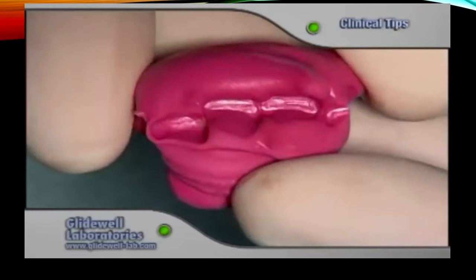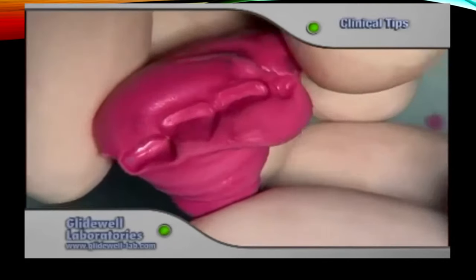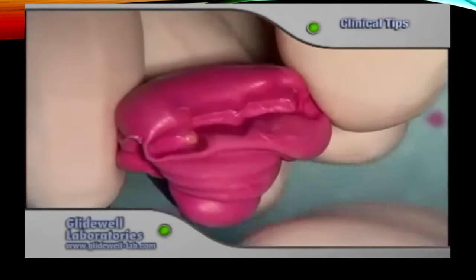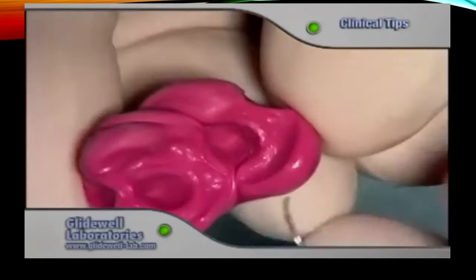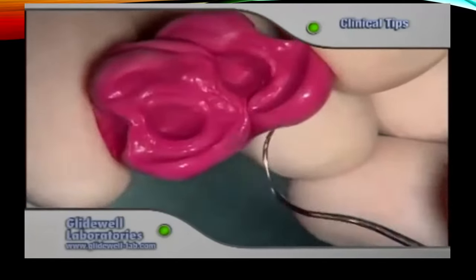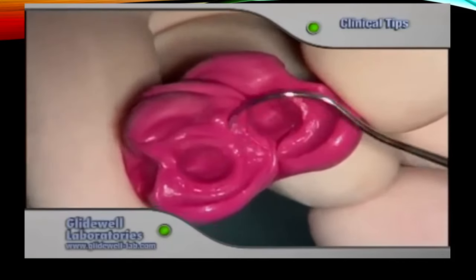Let's flip it over and take a look, and you can see on the opposing teeth we also have the incisal third registered there. And so the lab, when this comes to the laboratory, we're going to trim a little bit off this side and come over here. We're going to trim off the gingival margin. The other thing you can't have for a bite registration to fit on the model is any contact with the soft tissue.